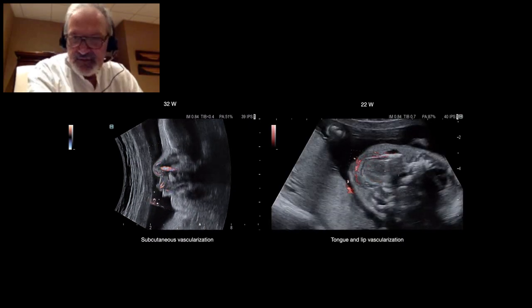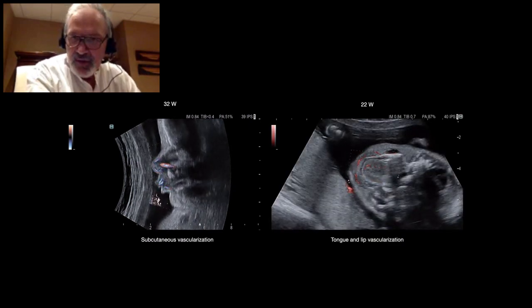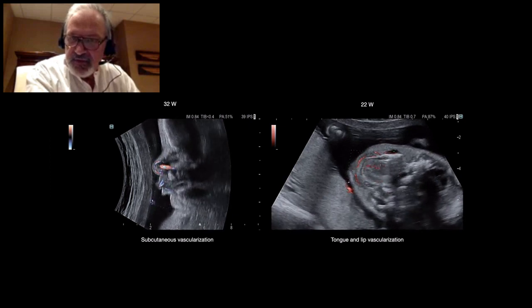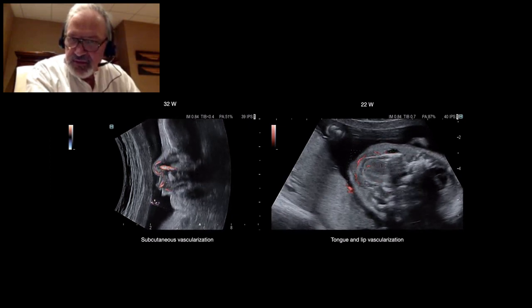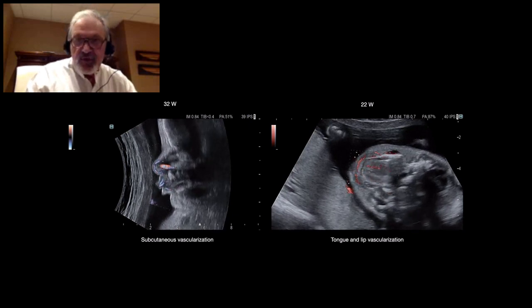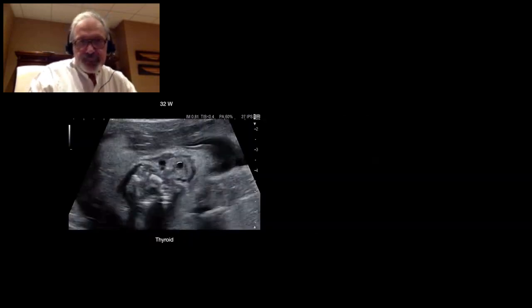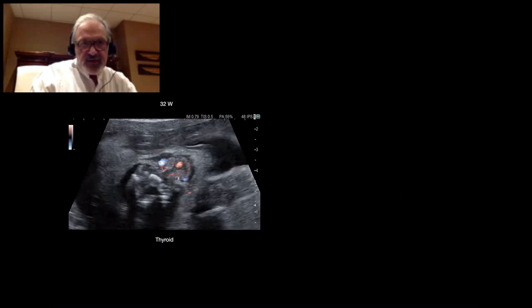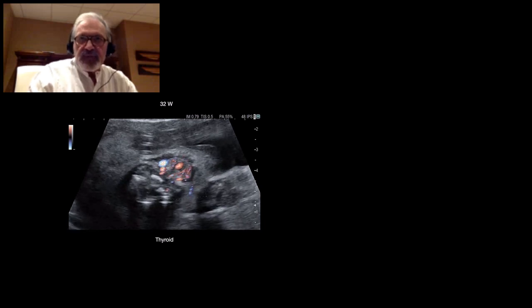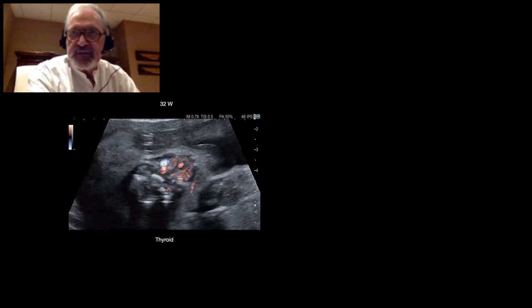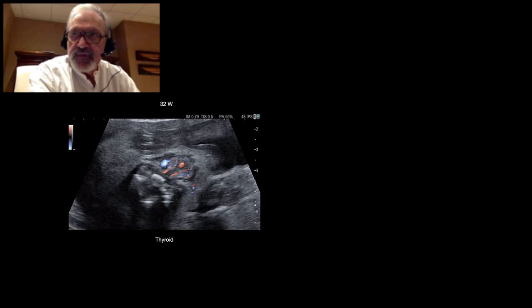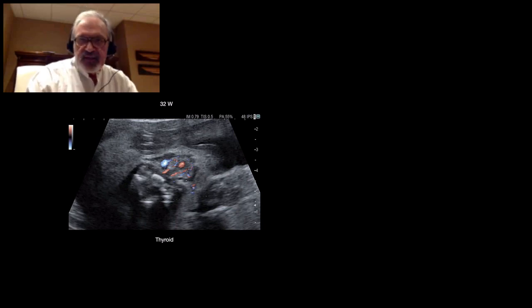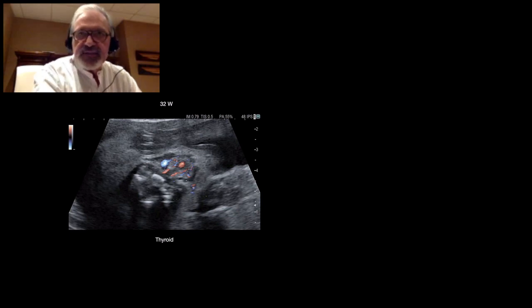Here is the transversal section. You can see the lower lip and the tongue, and the vascularization through the lips and in the tongue. This is a thyroid at 32 weeks. You can see the carotid and jugular vein. The vascularity of the thyroid is not visible when the thyroid is normal, but with DFI, its afferent vessels are visible, as you can see here.